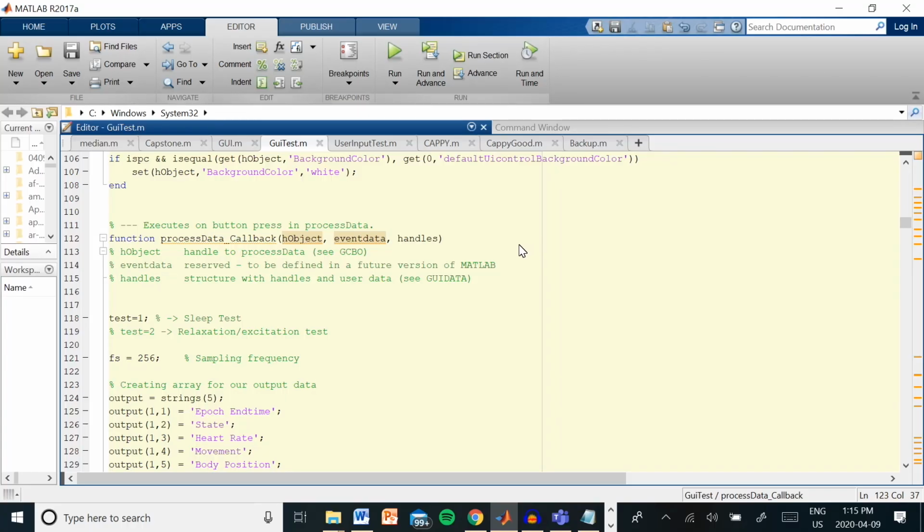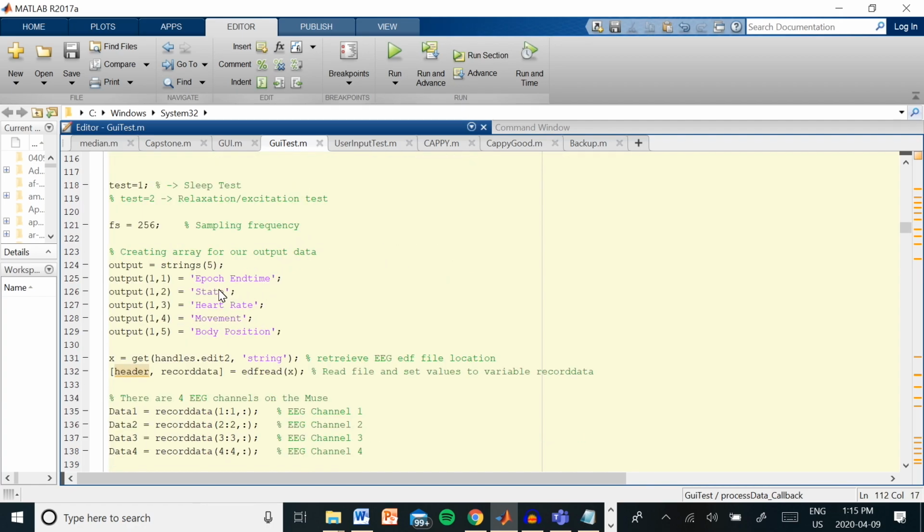The data processing begins as soon as the Process Data button is pressed. By processing our 3 types of input, we are able to calculate the sleep state, heart rate, amount of movement, and body position of the user.